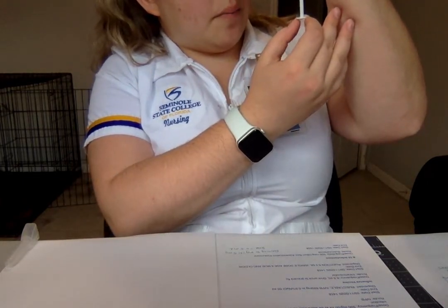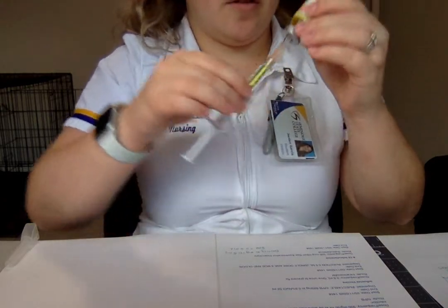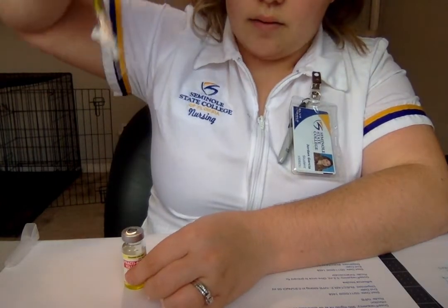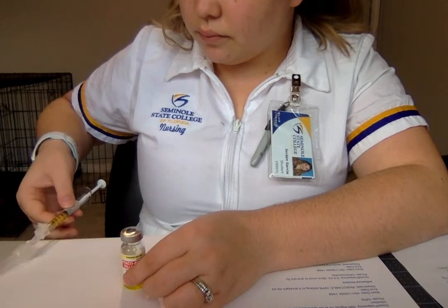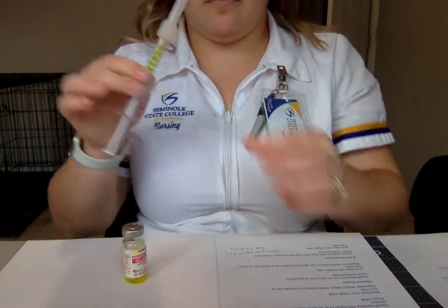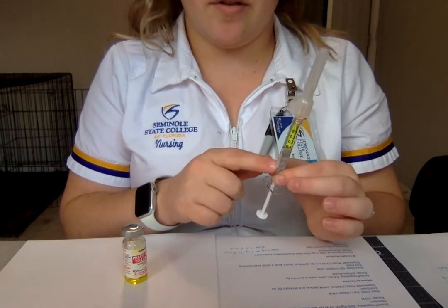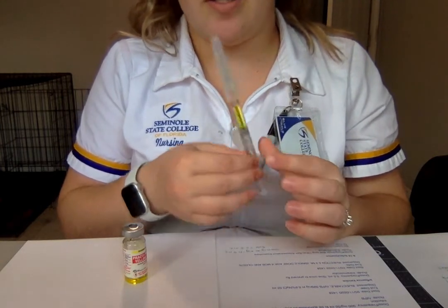Go to sleep there. Okay, now I've drawn out 0.5 mLs in here. Go ahead and pull out and do the one-handed scoop again. Okay, and then again, I will label this one with the patient's name, patient's date of birth, the medication, the dosage, the date and time, and my initials. And then I will go ahead and set that to the side.